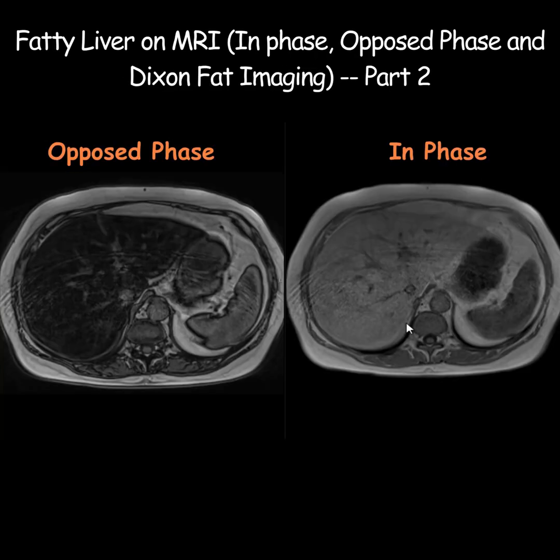Opposed-phase imaging causes a drop in the MR signal at the interface between water and fat — that's why you see this dark boundary or border. In comparison, the in-phase sequence doesn't have the dark border because it does not highlight the water-fat interface.